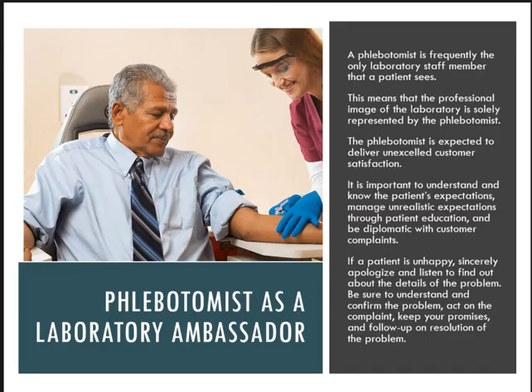Okay. Now next, phlebotomist as a laboratory ambassador, o 'di ba? Ambassador ta diring dapita. Why? Because phlebotomists are always the people who the patients usually see. Okay, so that is why they are expected to get like one shot. I think you may have heard this, but there is a bit of discrimination siguro sa mga medtechs who are not able to get blood from a patient using only one syringe. So that's why some patients usually say, "Kas alang tusok ha," or "one shot lang ha."